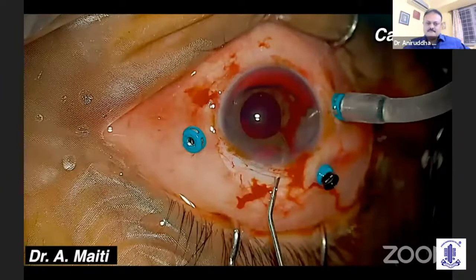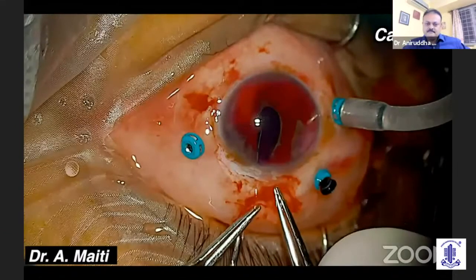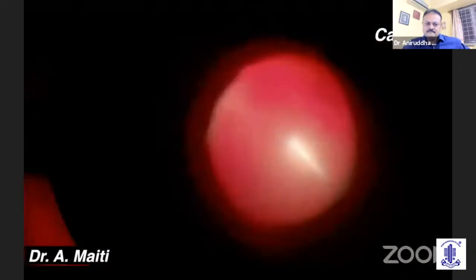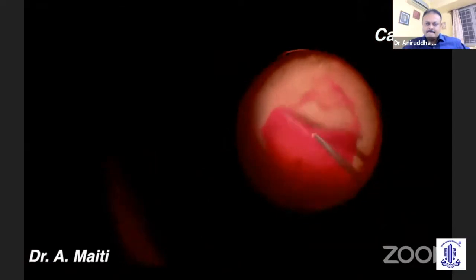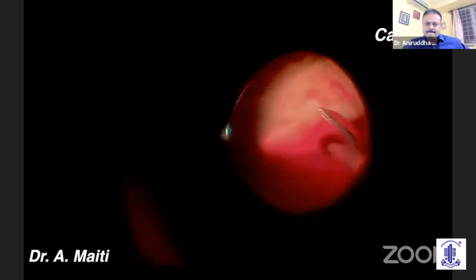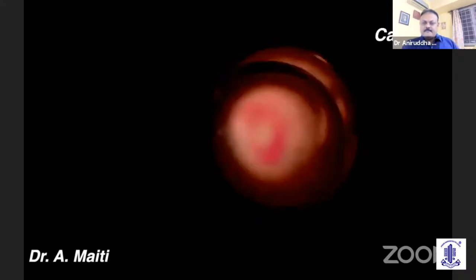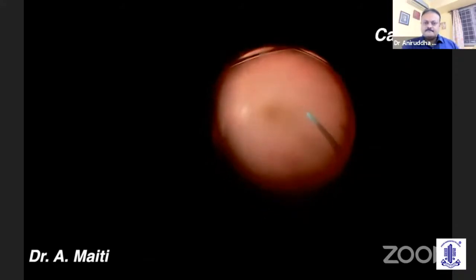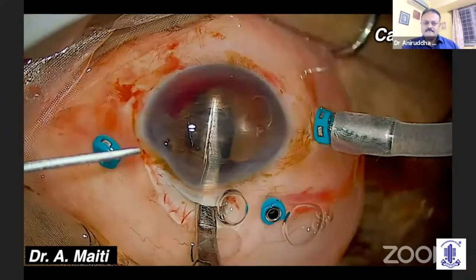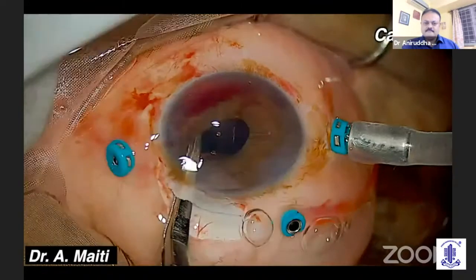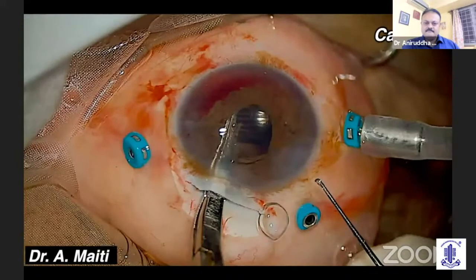I ultimately succeeded in releasing the IOL from the iris and made it free. The IOL was then taken out. By this time, the posterior chamber was full of blood, which was gradually aspirated by the cutter. Thick clotted blood deposited in the posterior pole was gradually removed. A posterior fixating iris lens was then fixed on the iris. We could manage the case and give good vision to this patient, but we need to be careful while retrieving the IOL from the posterior chamber.